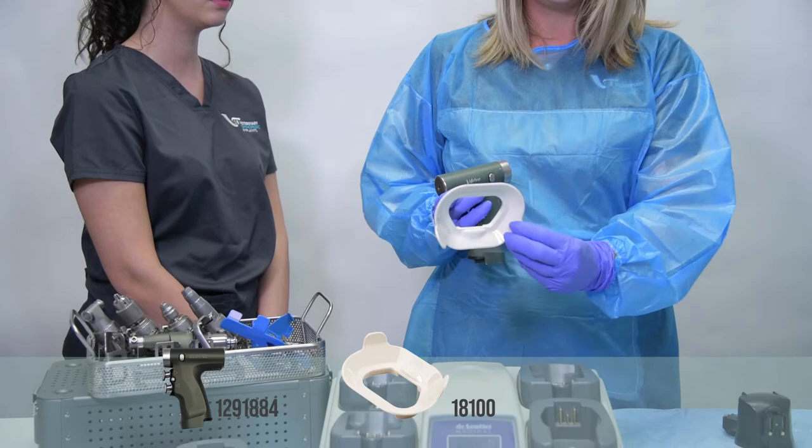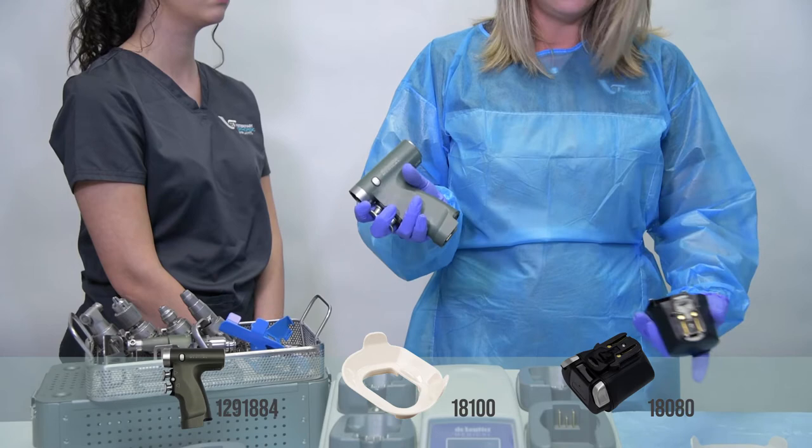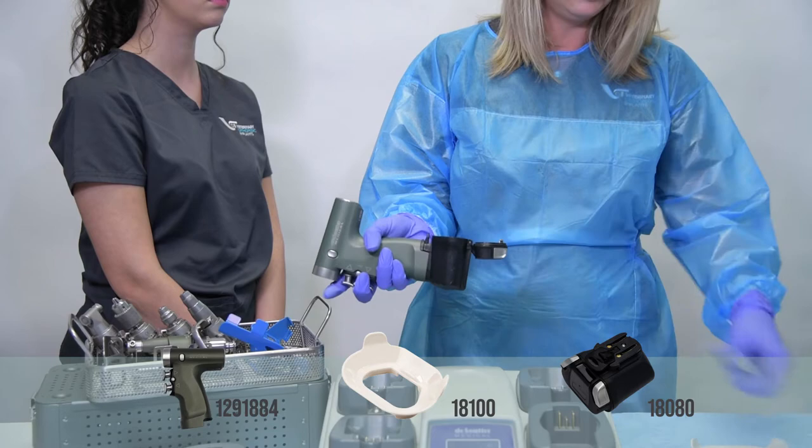You're going to utilize your handpiece, your shield, and your housing. All three items are going to be sterile at this point. You're going to take your sterile handpiece and apply your sterile battery housing to your handpiece with a secure click.